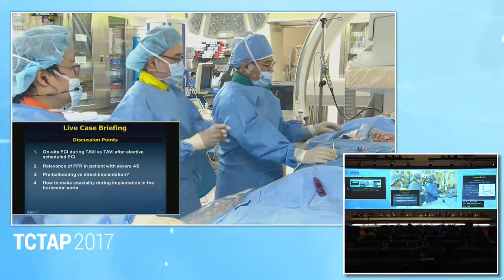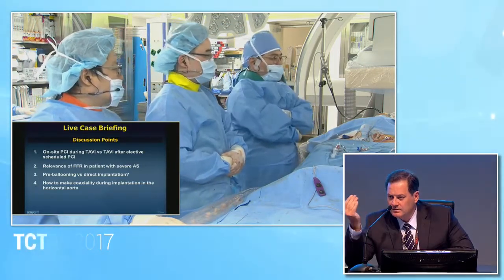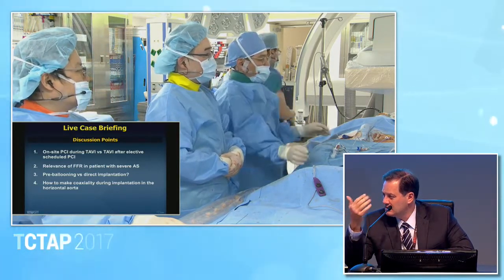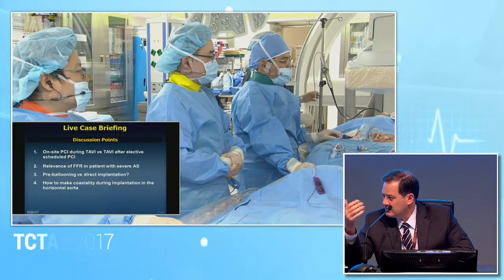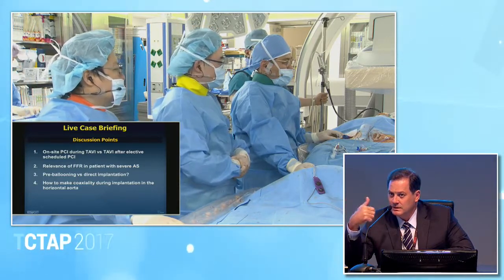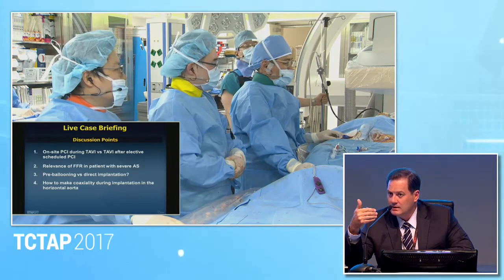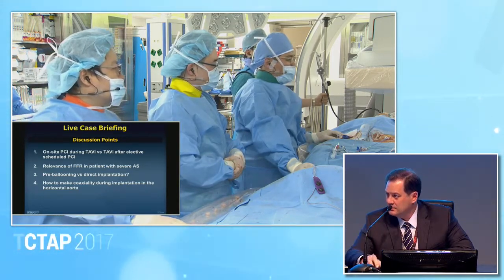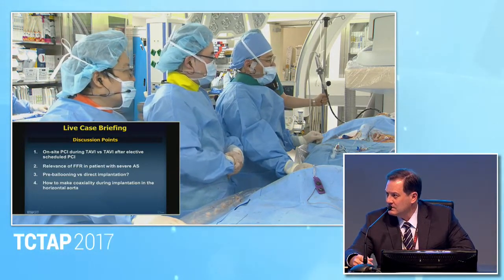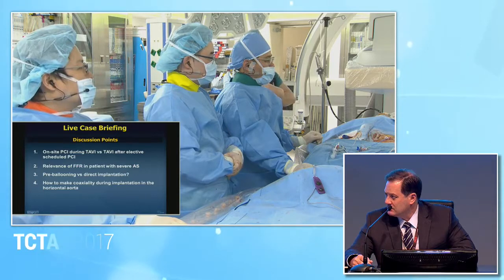Darren, what would you do? Well, if there's significant proximal epicardial stenosis, I think we routinely revascularize them ahead of the TAVI procedure. It unnecessarily complicates the TAVI procedure, affects the whole flow of the case list for the day. So we find it simpler to electively revascularize where we need to, and then implant in a staged fashion. Prefer not to try to revascularize after implantation of a stent, particularly through the side strut, say, of a CoreValve or other. You can't always be guaranteed of good access.